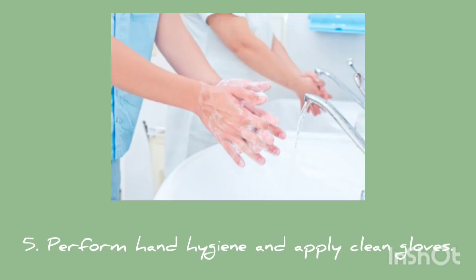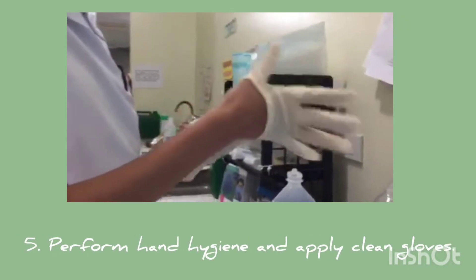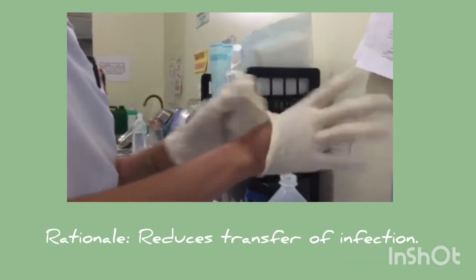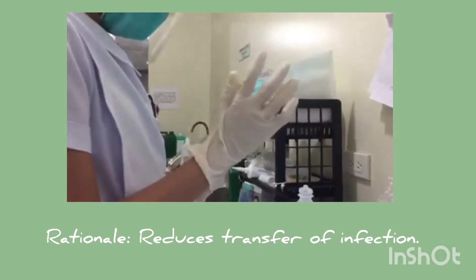It also helps minimize the patient's anxiety. Fifth, perform hand hygiene and apply clean gloves. This is to reduce the transfer of infection.